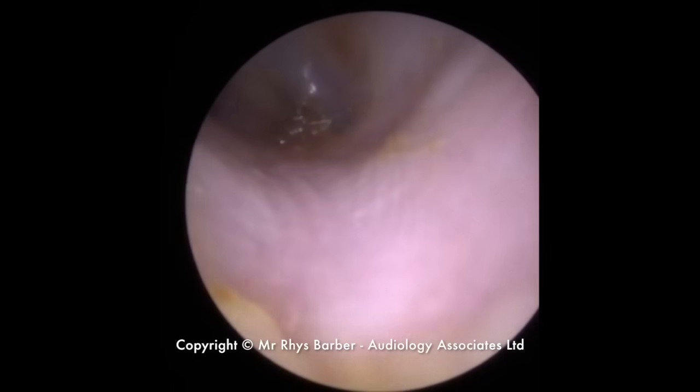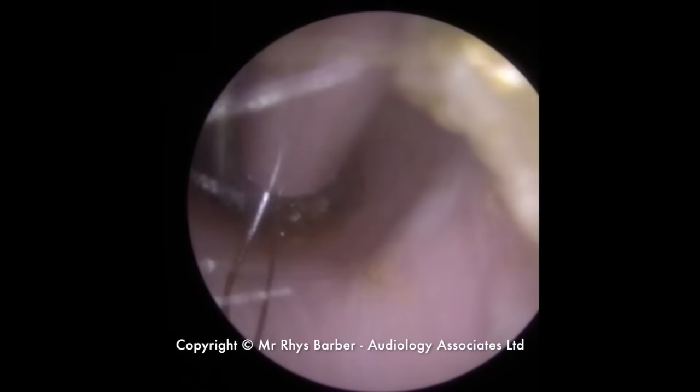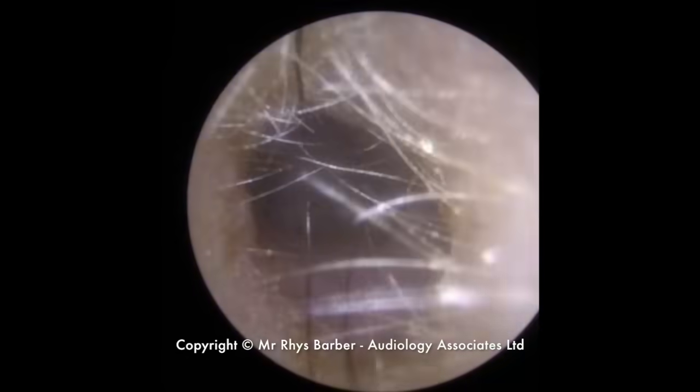See that long strip there. I'm going to go back in — there's a tiny little bit of wax there, so we'll remove that. You can see a little bit of red, and there's a little red dot on the eardrum as well. I've just pulled a hair in from the outside there as well — it's still attached to the head, so it will come back out with the suction.